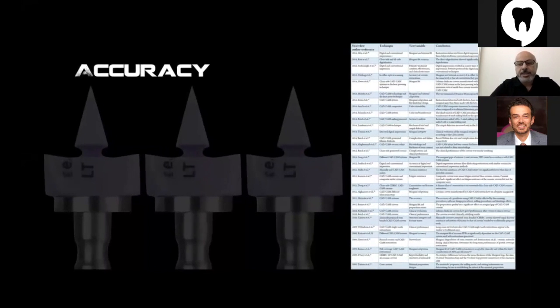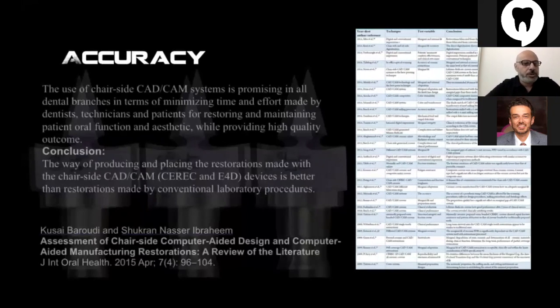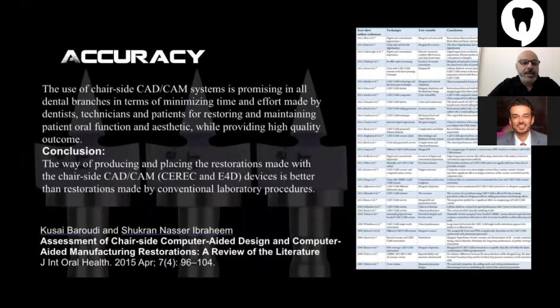But as you can see, there is lots of literature all around, and this is just an example of it, that at the end, the conclusion: the way of producing and placing restorations made with chairside CAD-CAM is better than restorations made by conventional laboratory procedures. This is one of the examples. We have lots of examples, actually.